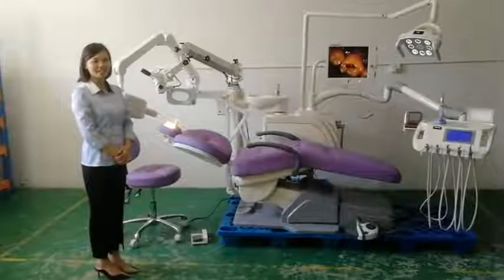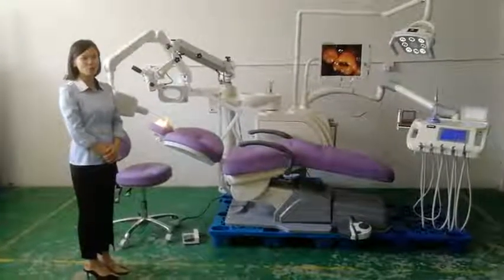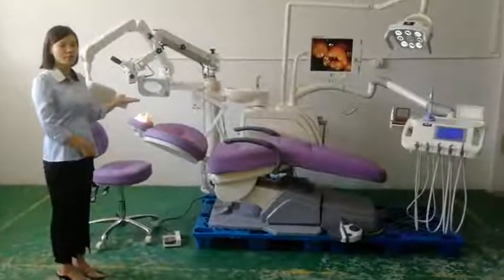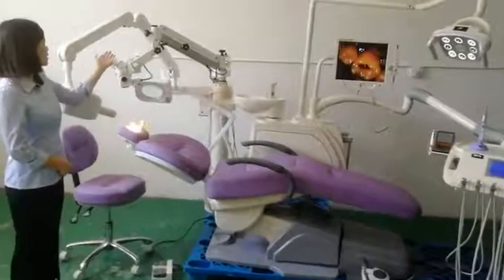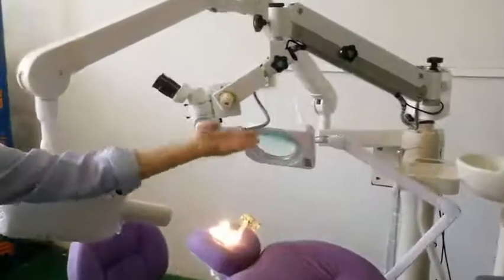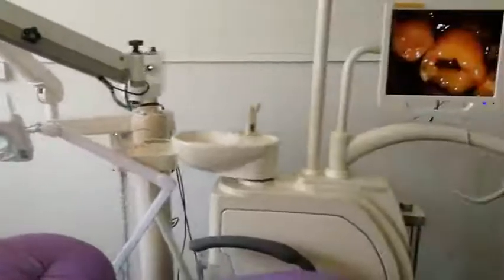Hello, this is Sophie from Linchen Dental. Today we share with you this center cleaning unit, which can finish all the treatment by one unit. It is with the beauty microscope, x-ray, chair, oral camera, and foot options.